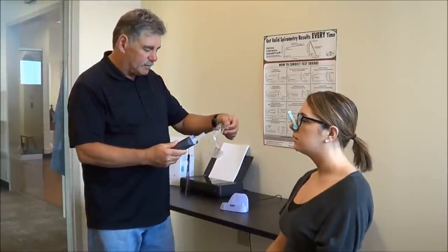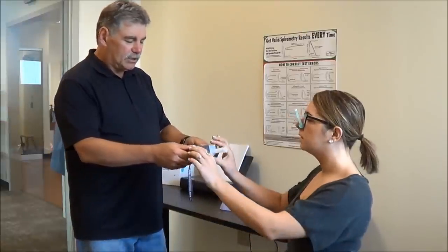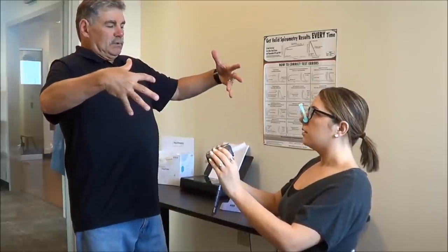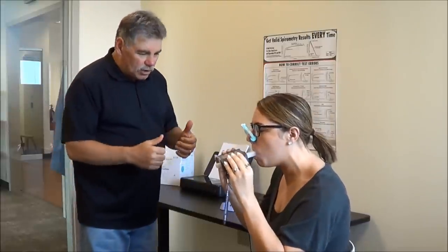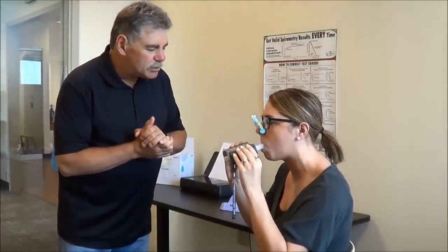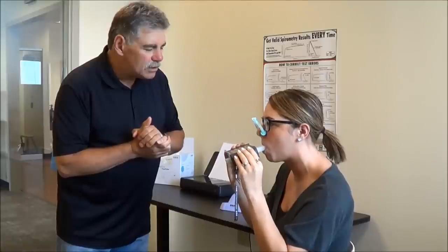Now I carefully remove the bag, hand the device to Tina, and say, fill your lungs completely. Put it in your mouth when you're ready, and blast. Go, go, go, keep going, push, push, push, keep going till I tell you, go, go, go.